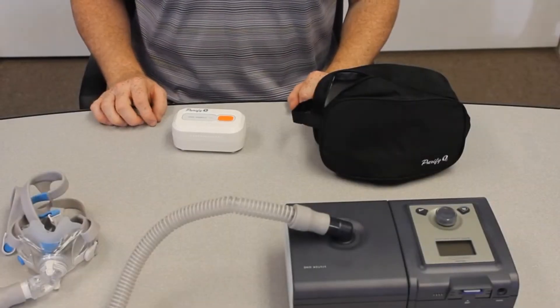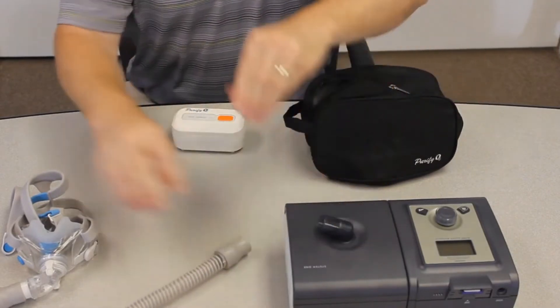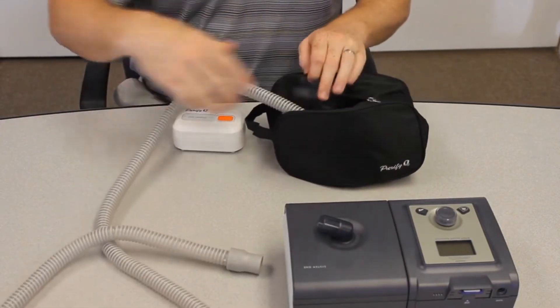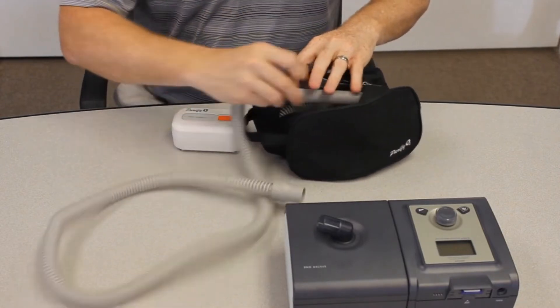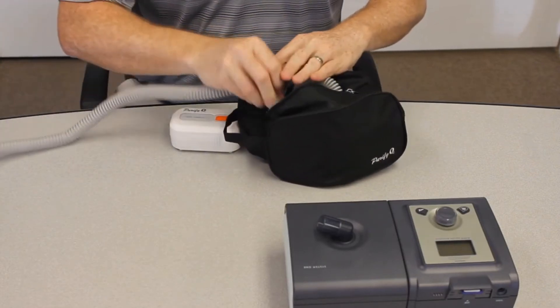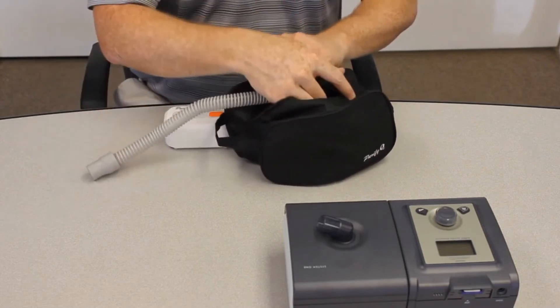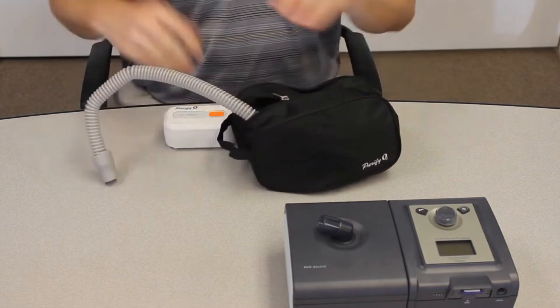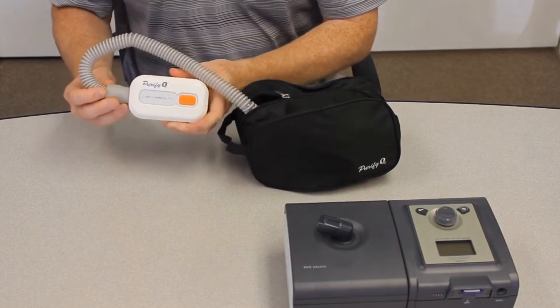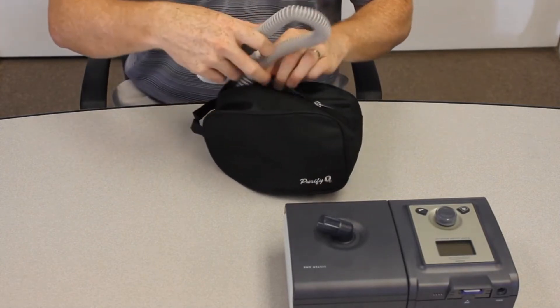We're now going to demonstrate how to sanitize our mask and tubing. Disconnect the tube from the machine, go ahead and put our mask into the sanitizing bag, and then put the tubing in there as well. Turn on the Purify O3 and connect it to the CPAP tubing, then go ahead and put the entire unit into the sanitizing case.